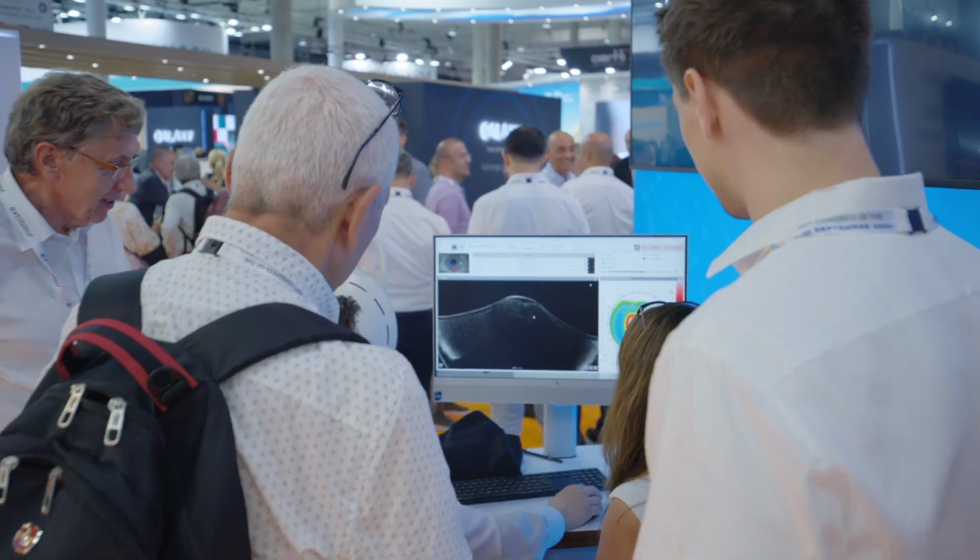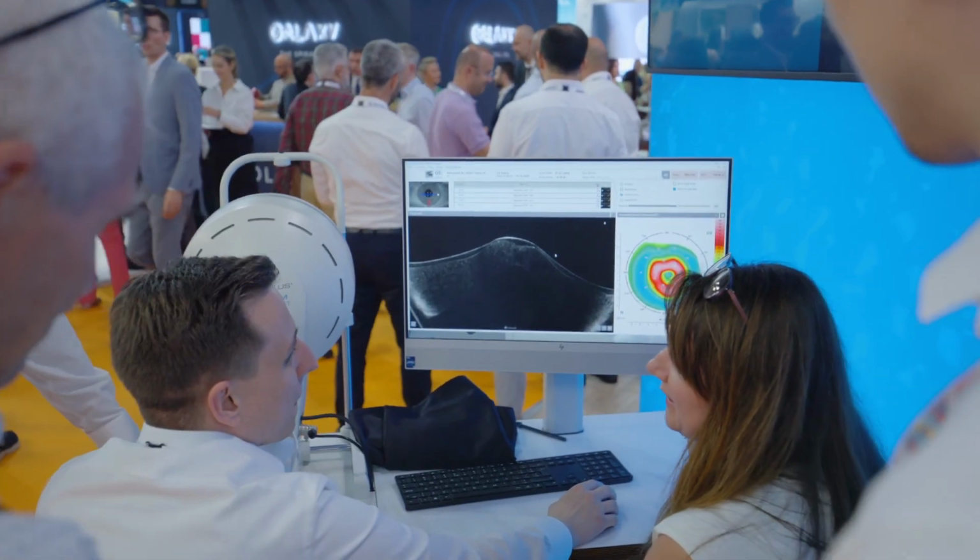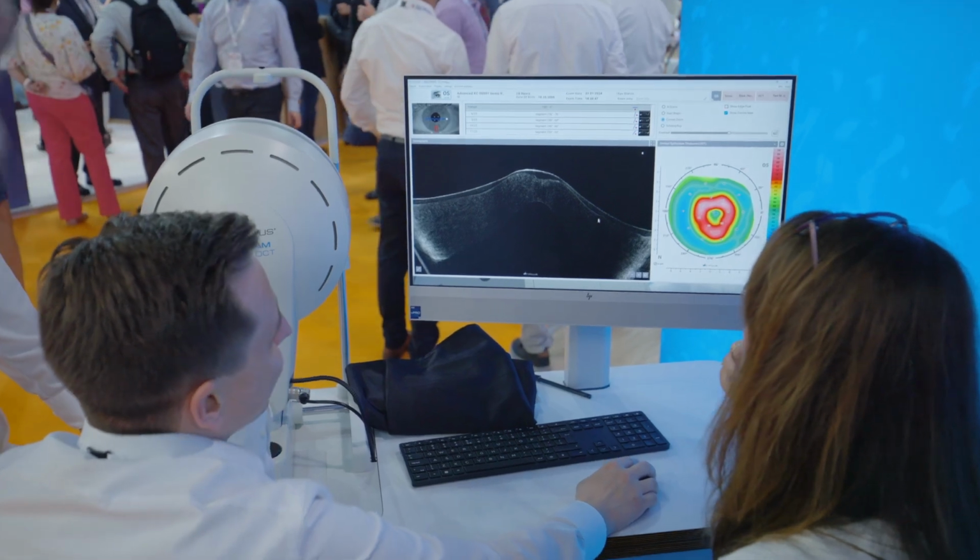You can visualize the scar in a tissue or any lesion in a tissue. You can really connect this to the topography deformation and exclude, for example, an early ectatic process or a corneal warpage due to eye rubbing, things like that, right? If you want to plan a correction for a scarred cornea as well, you need to have special information on where the opacity is, what's the depth of it, and that's key information for any planning. You may want to use this information to guide a specific treatment to make the cornea smoother.